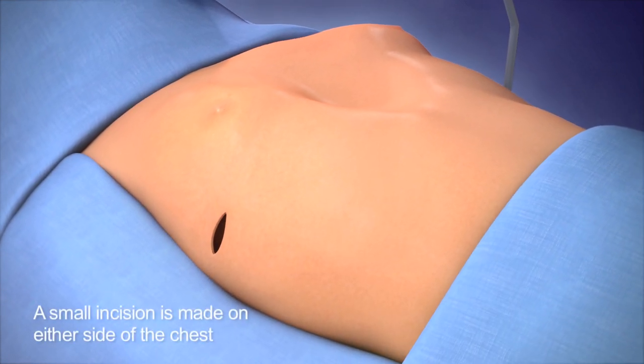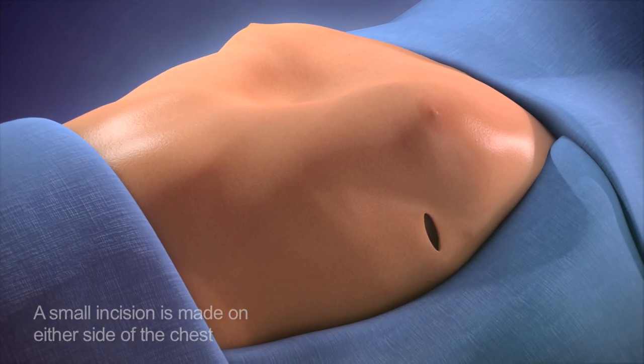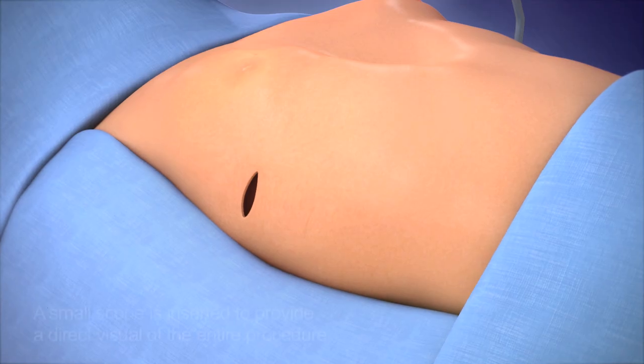To begin, two small incisions are made on either side of the chest, plus a small incision for a scope which will allow for direct vision during the procedure.